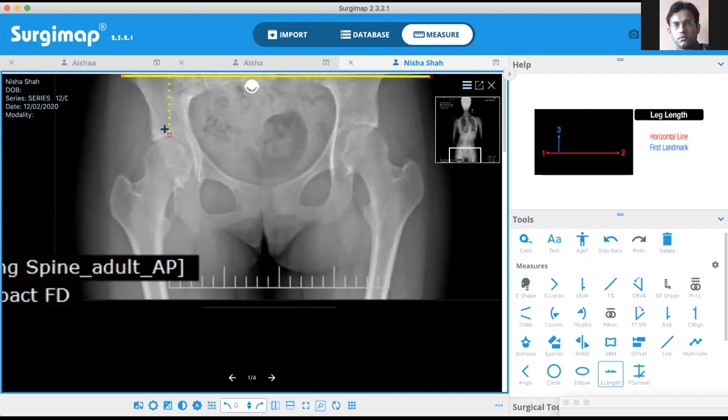So it will basically tell us where the acetabulum is placed with respect to each other. So that's 12.9 millimeter. Again, it will be one of the surrogate measures of checking why the pelvis is oblique. Here, Kshitij, we are not actually checking the limb length discrepancy. Yeah, we are just taking an estimate. Yeah, it's an indirect way.